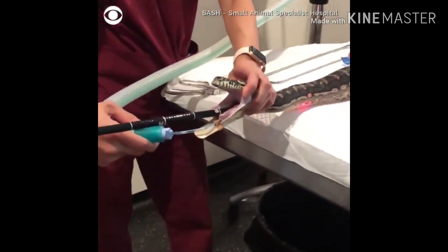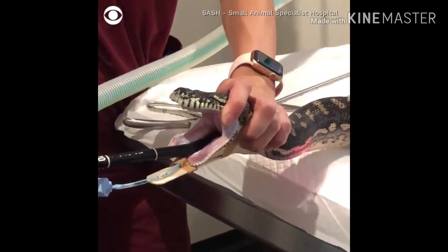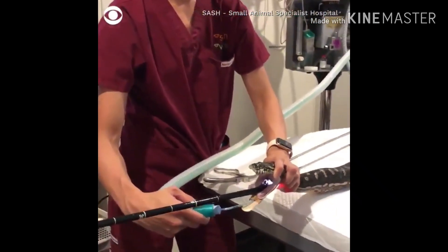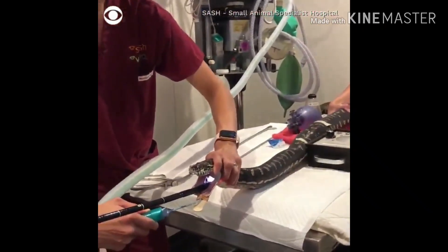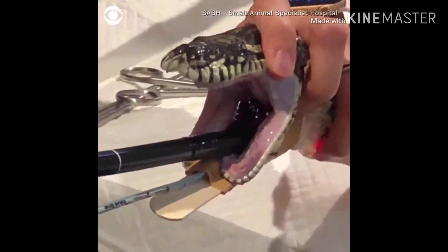You keep pulling the scope, you keep moving the chin. It's coming out. Yeah. Have you got one thread mover? Go back a bit in there. Yeah.